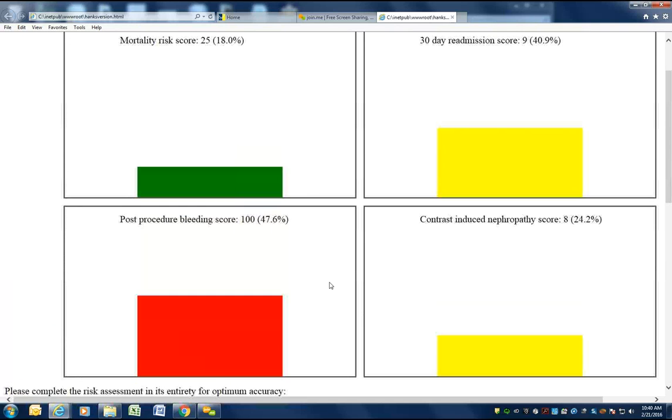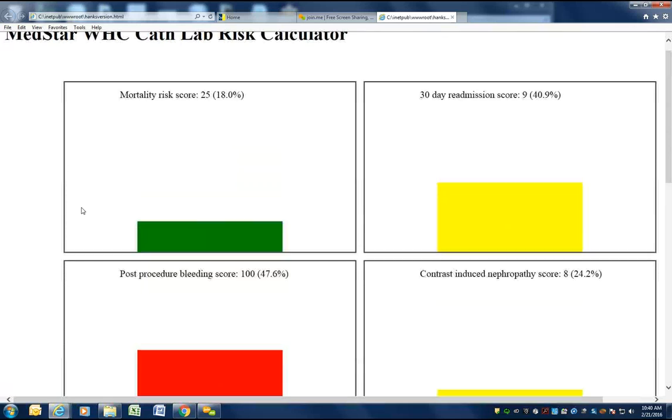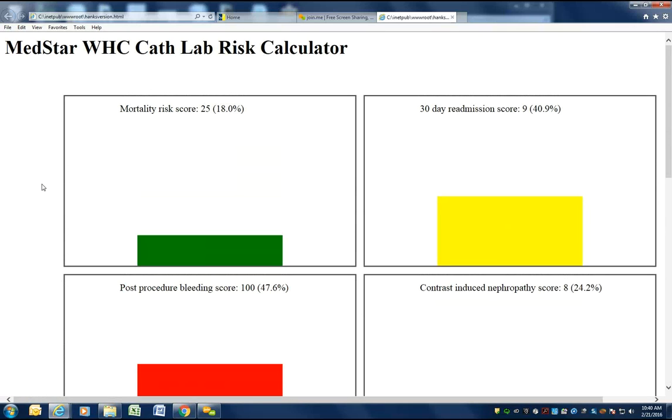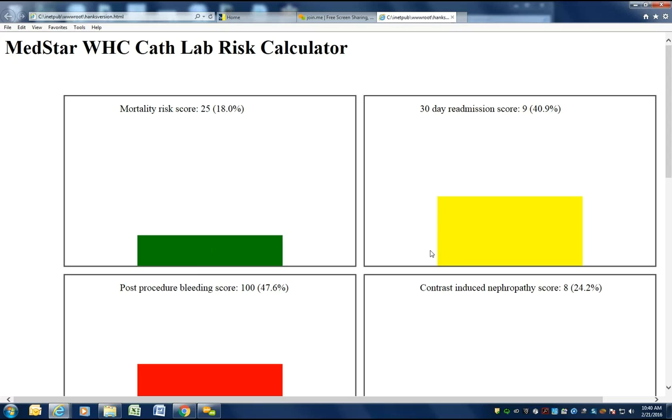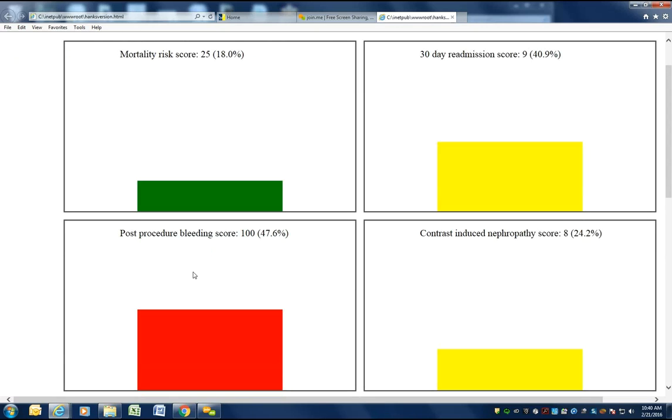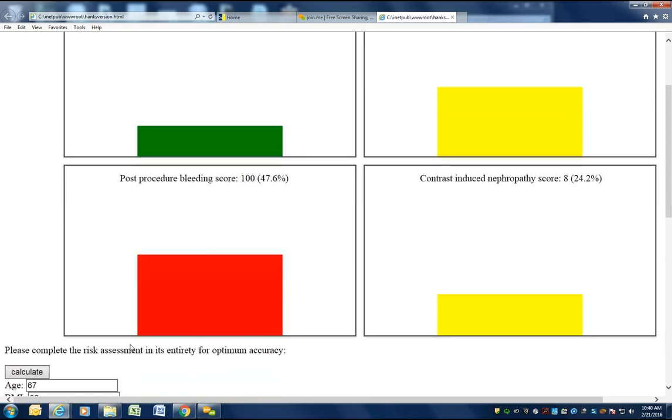the four graphs indicating the metrics are easily highlighted for the clinical team to see. As with this particular example, mortality risk is low, designated with a green score. 30-day readmission is intermediate risk with a yellow bar. Post-procedure bleeding is a high score indicated by the red bar, and contrast-induced nephropathy is intermediate with the yellow bar.